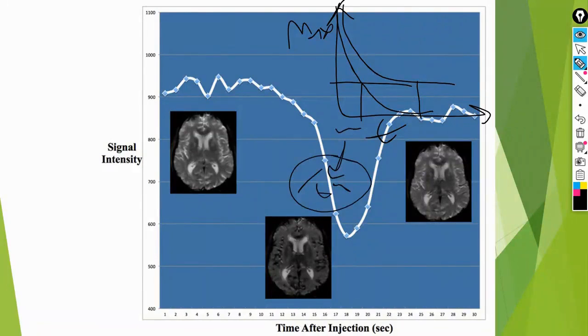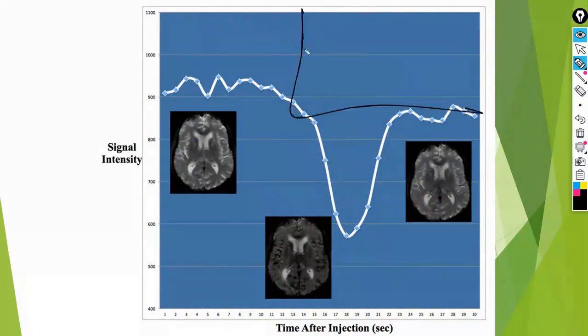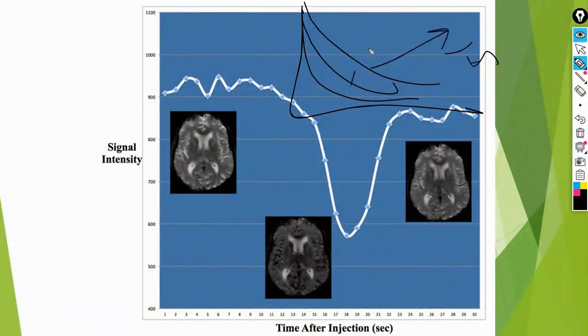Now let's consider magnetization. If we assume that the rest of the tissues are the same, this is the tumor. And what about the other tissues? Which one of them has the lowest magnetization and which one has the highest? The tumor has the lowest MZ of them. This means that if I want to measure at a certain time, I can do so.